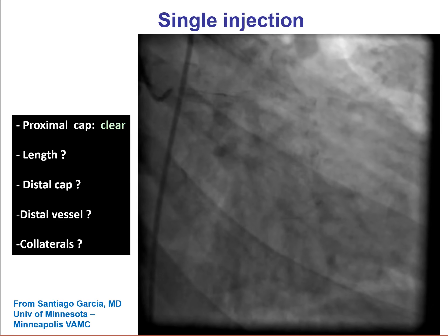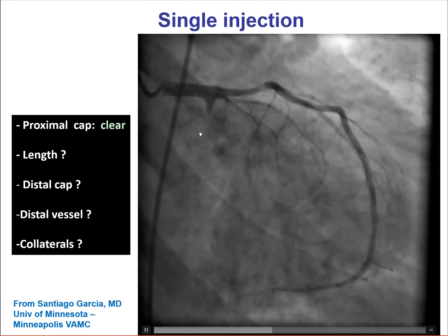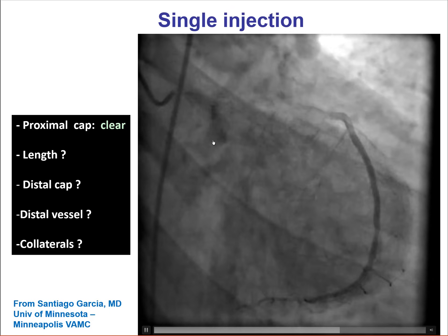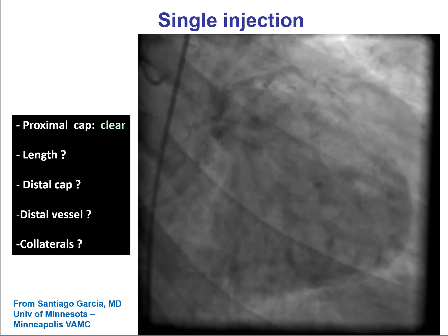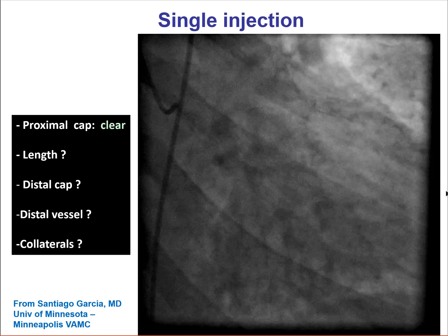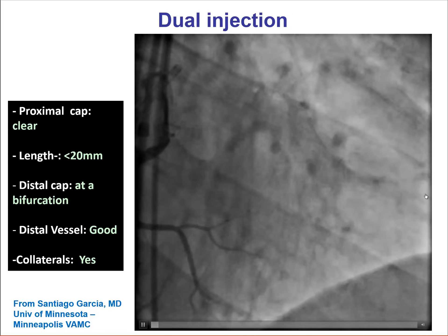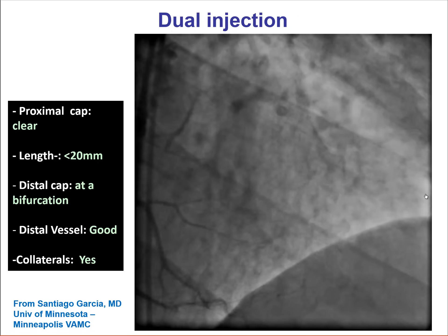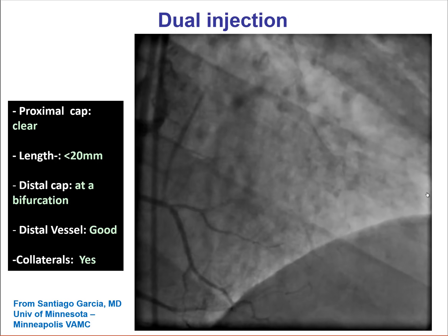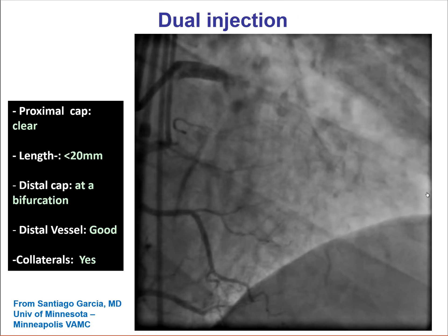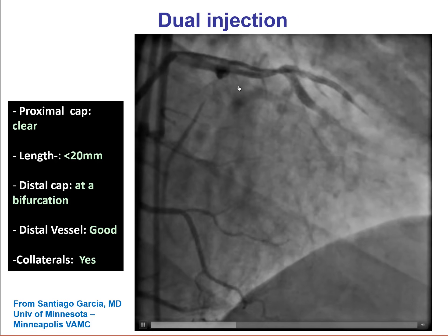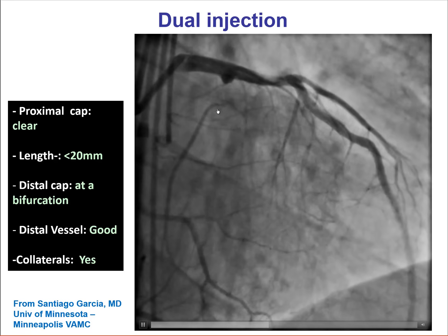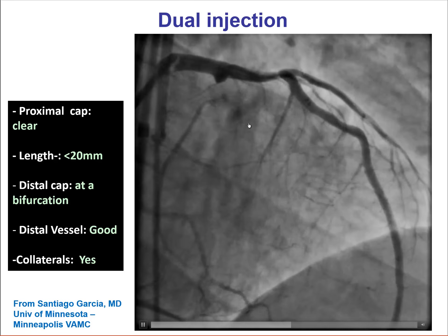This is another example of a proximal circumflex CTO, which is again difficult to appreciate before dual injection is performed. However, using dual injection through the right coronary artery, one can see that the occlusion is actually fairly short and the distal cap is at a bifurcation.